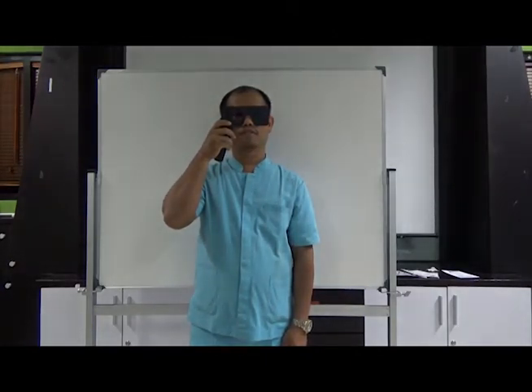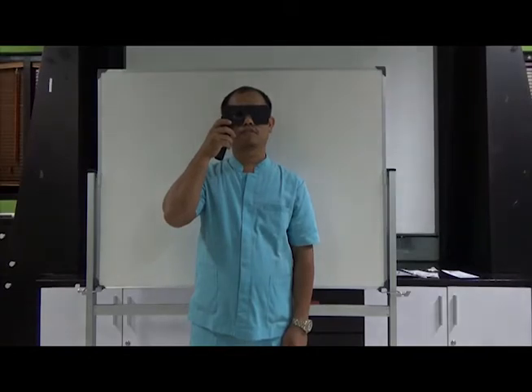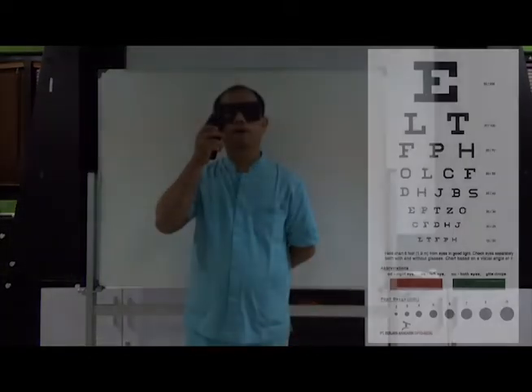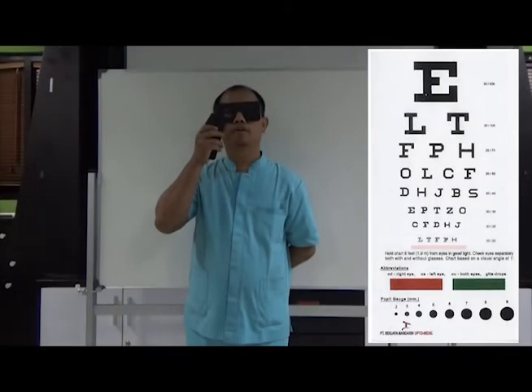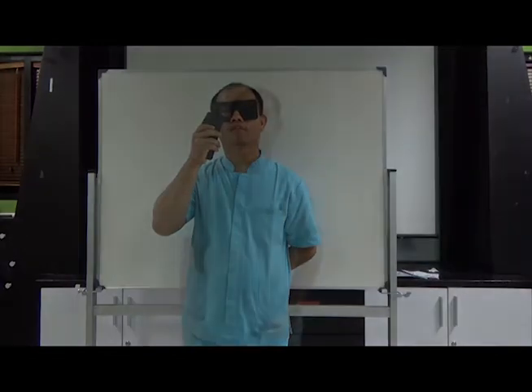Now, can you please try to read a line of letters that is most visible for you? Then ask your patient to cover their other eye.